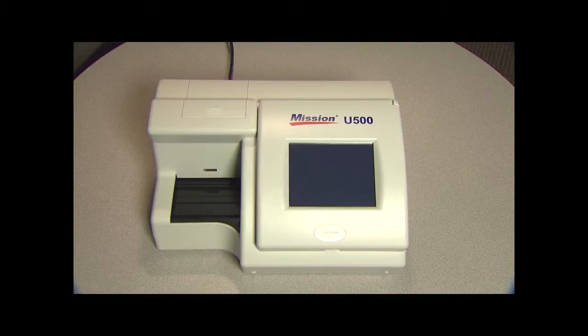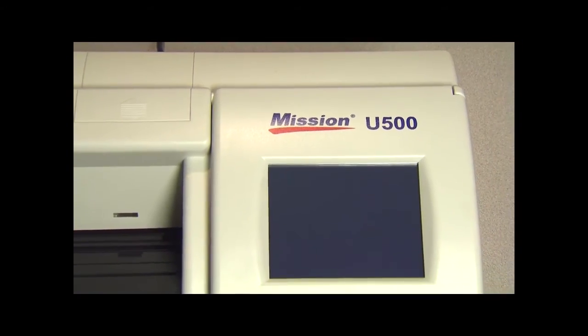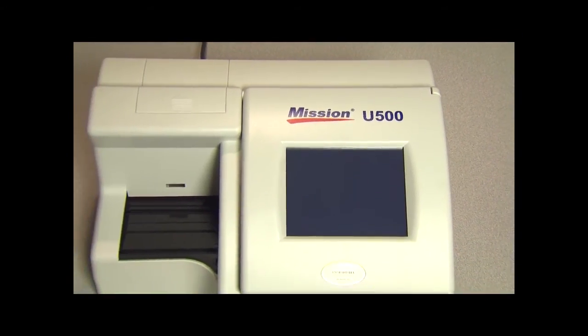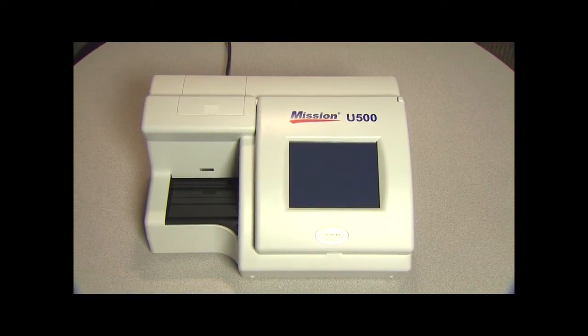Welcome and thank you for choosing the Mission U500 Urine Analyzer. The Mission U500 is a semi-automated reflectance photometer that analyzes the intensity and color of light reflected from the reagent areas of a urinalysis reagent strip. It has a throughput of 500 tests per hour and a measuring cycle of 7 seconds per test.